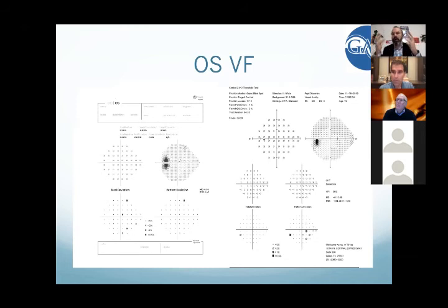When you are on the virtual reality platform, it creates some sort of isolation from the rest, and there is nothing virtually to look at within that headset other than the fixation point. And as you know, physiologically speaking, it's very difficult not to follow the fixation. That's what we believe is related to it. Right.